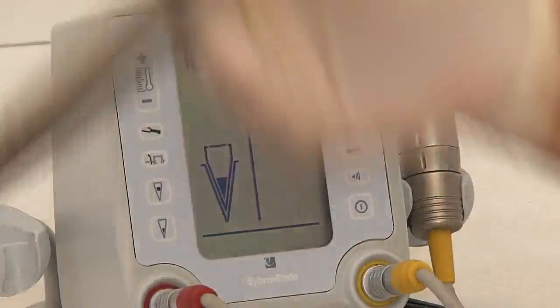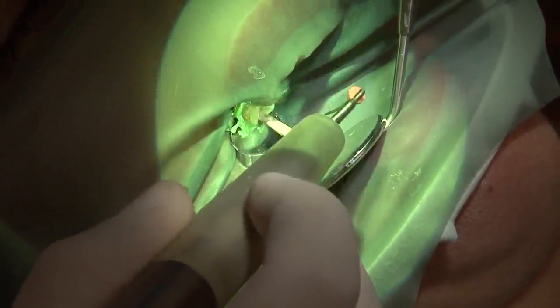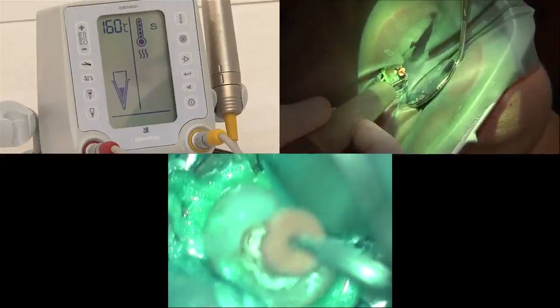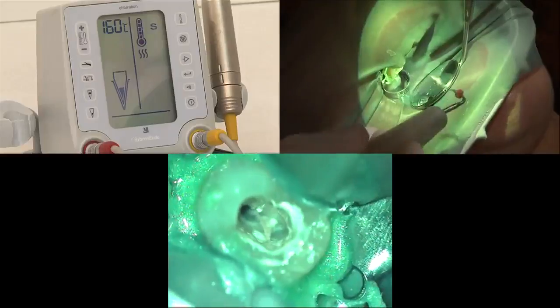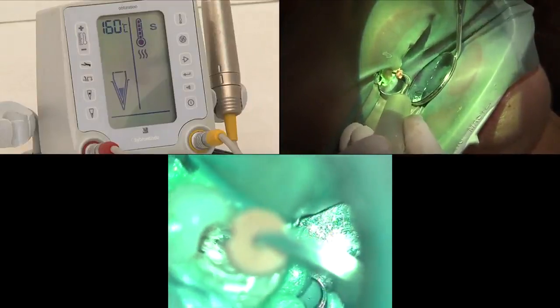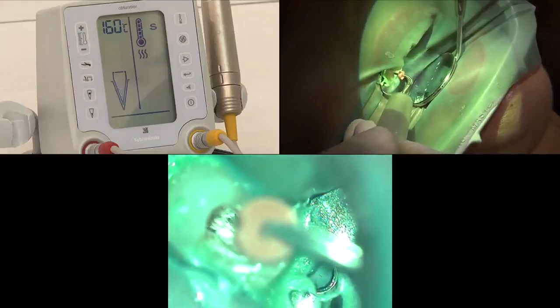Both master cones are inserted and we put a coat of sealer. At 160°C for the down pack using the System B plugger, I cut the master cone at the orifice and use a hand plugger to seat the orifice, creating maximum hydraulic pressure. Then the System B is pointed in the middle of each canal. The down pack is done in two to three seconds, one millimeter prior to the pre-calibrated length. I switch off the power and continue until the rubber stop reaches its level. I stop for 10 seconds — the unit gives a small beep — then activate for one second like a thermo-cut, and take back my plugger. The down pack is completed.